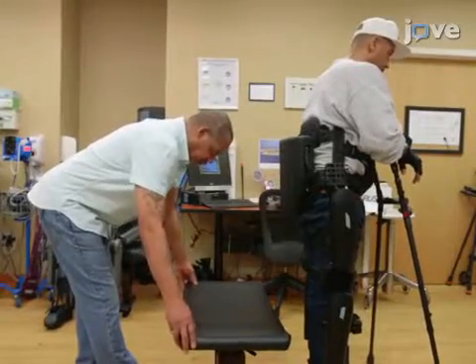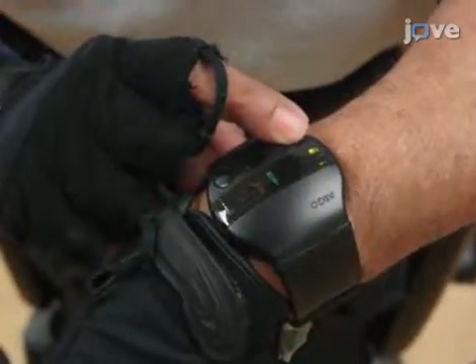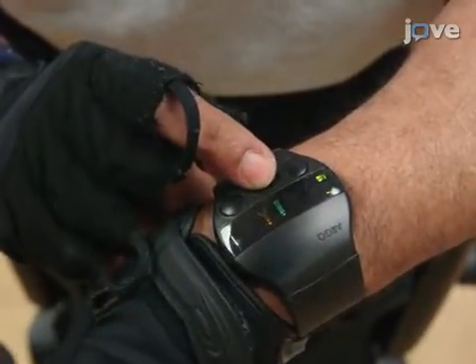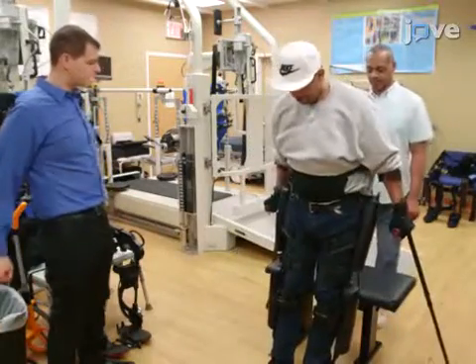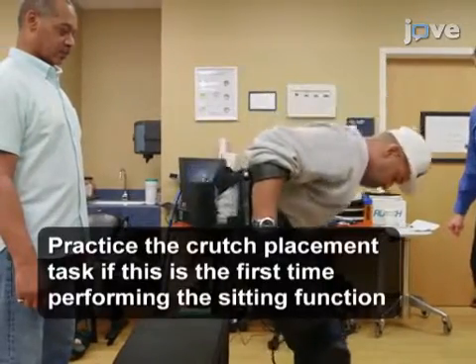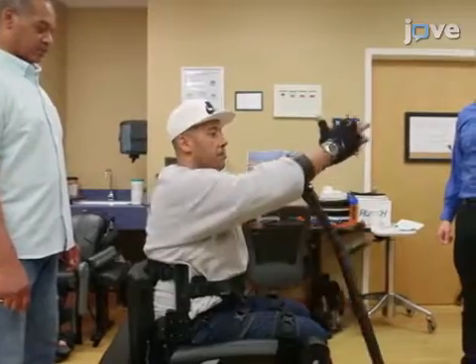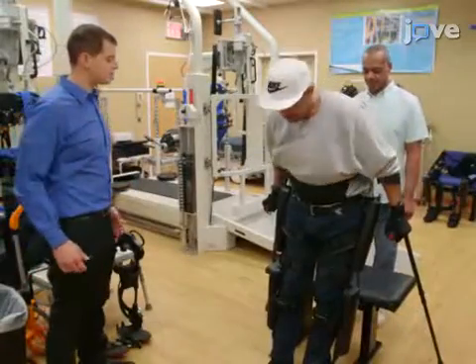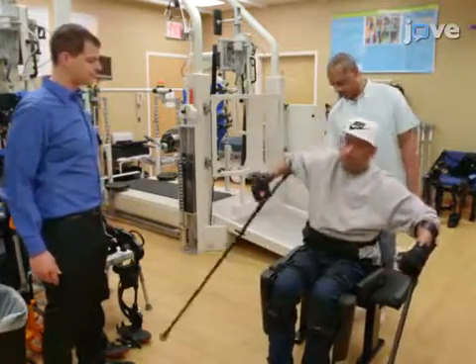Begin by placing a chair behind the user when they are ready to sit. Use the controller of the exoskeleton to activate the sit mode, for which there is a 5-second delay. During this delay, ask the participant to place their crutches posteriorly to maintain their center of balance over the chair. Finally, during the sitting process, instruct the user to bend forward at the hip to maintain balance over the feet, and have the trainers assist the participant as needed.